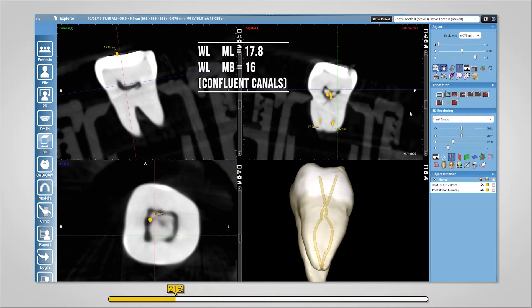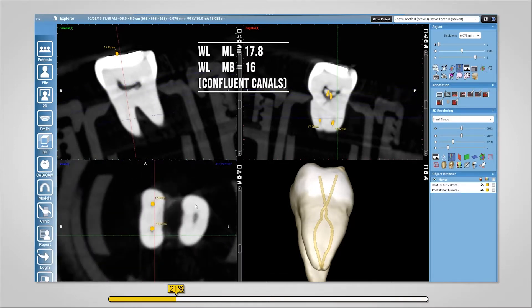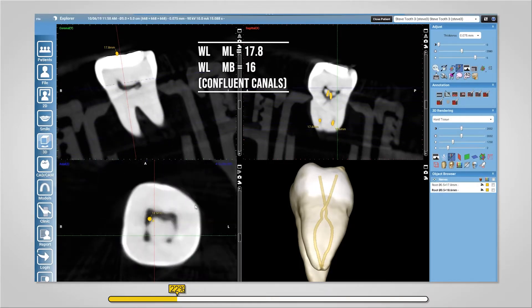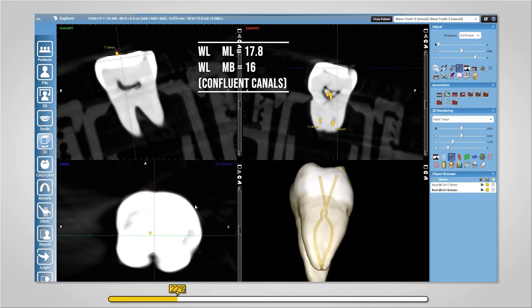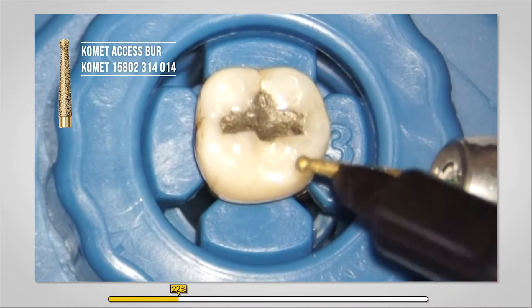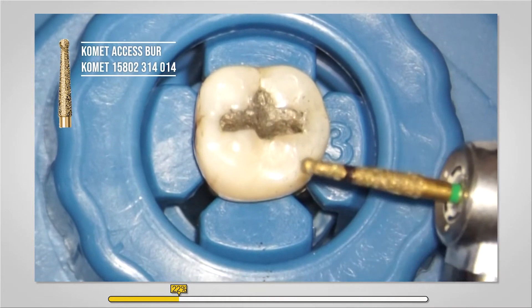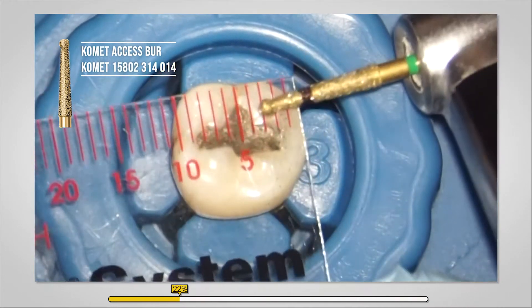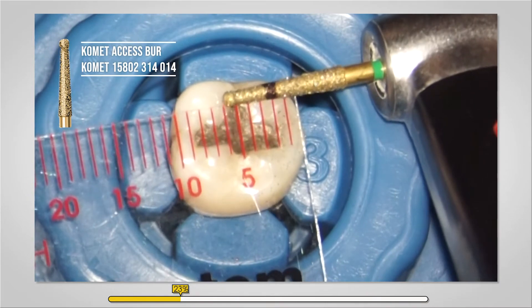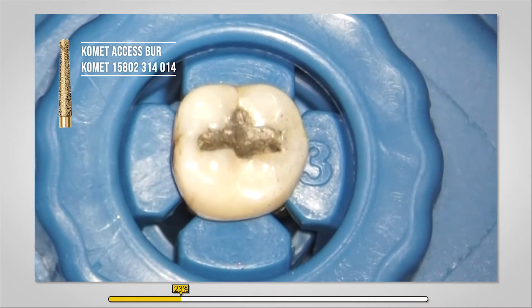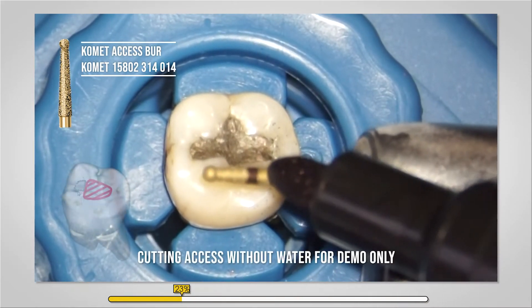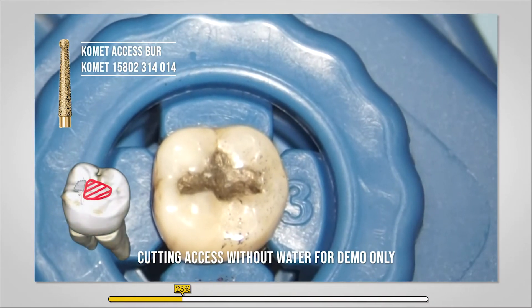Which really is satisfying because you know what you're up against, and these curves are not insignificant. So that's a 4 millimeter mark there. This is a really nice bur to start cutting your access cavities — from Comet, actually. Comet have a wonderful range of access burs. There's our outline form in the bottom left.